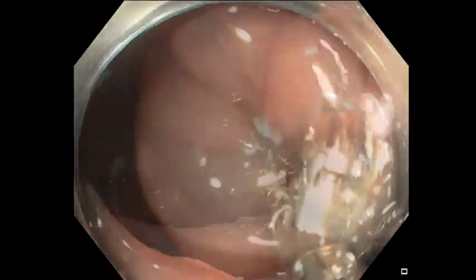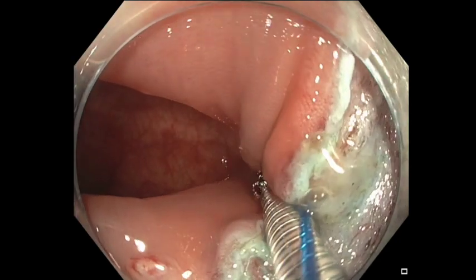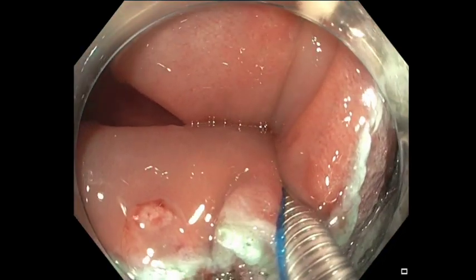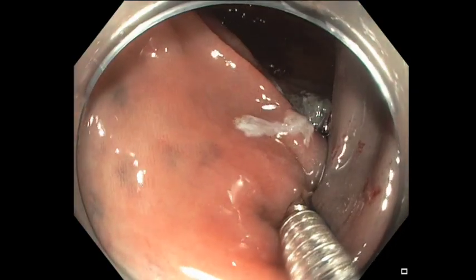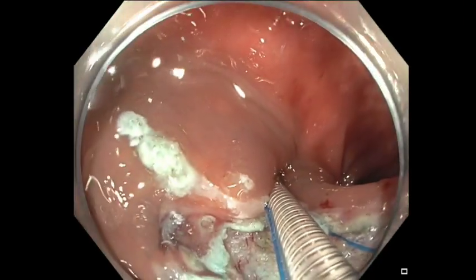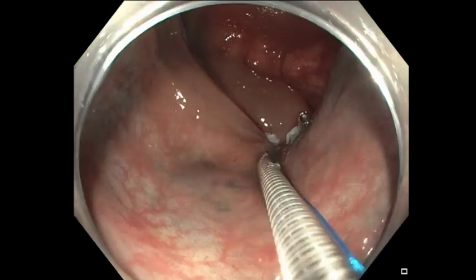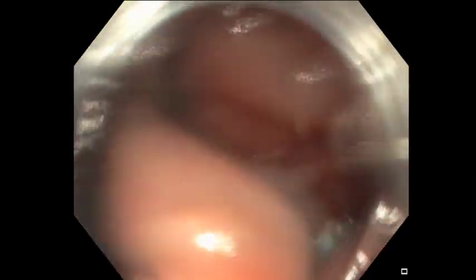So I usually try to close up to 4 centimeters with these TACs, and they work the best from the distal margin to the oral margin. So you go distal, oral, and you use it in a zigzag pattern, as you can see here, 1, 2, and this is the third TAC on the back side. And then the fourth TAC, I'm going to put it on the other side here.